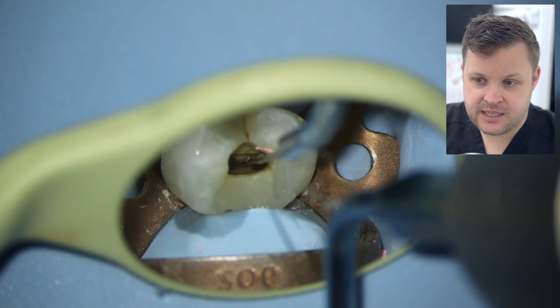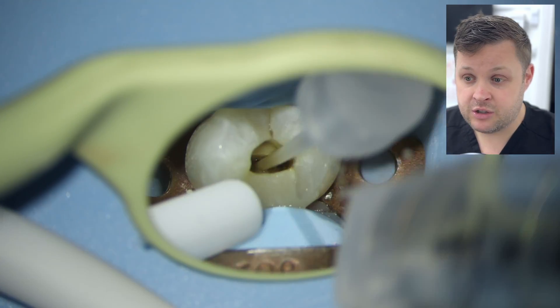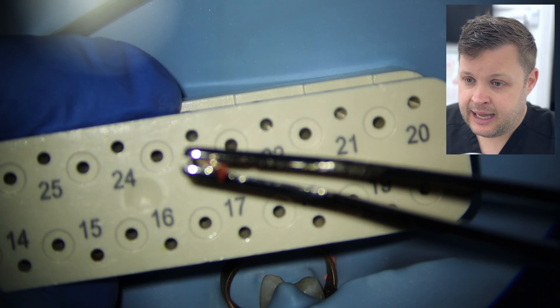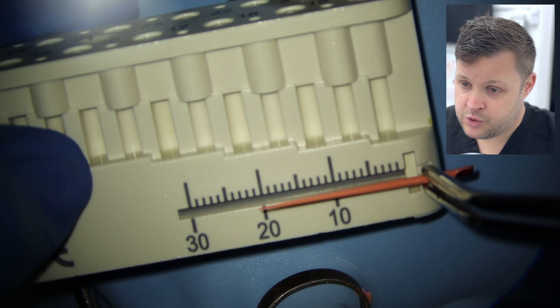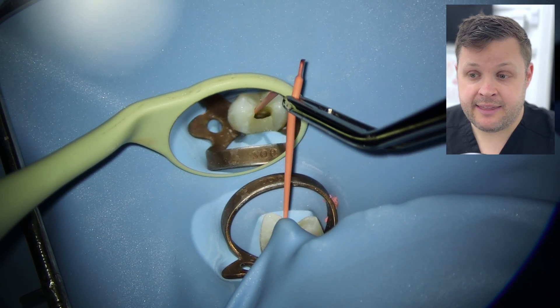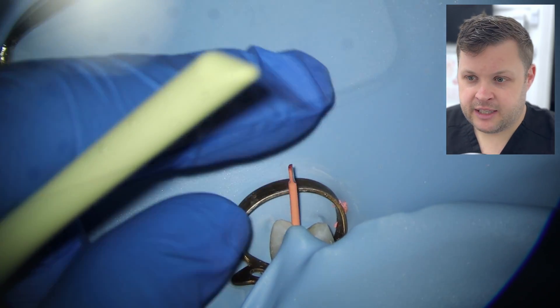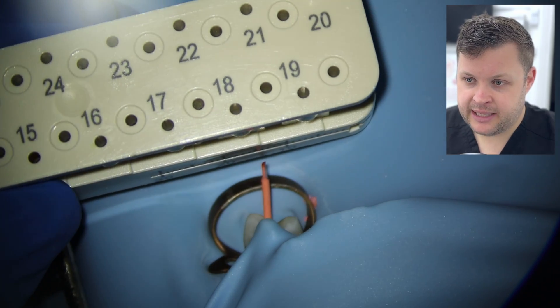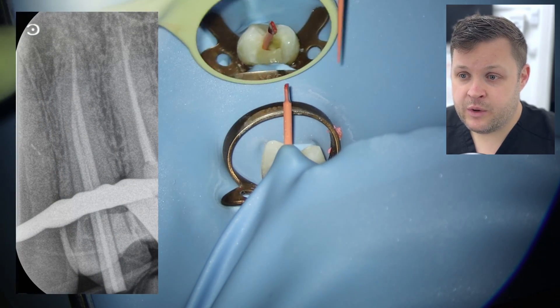I use the Ultra-X ultrasonic activator to activate the remaining GP — I've now used it for three things, showing how versatile it is. Then we proceed with the final irrigation protocol: sodium hypochlorite throughout the appointment, followed by EDTA. Now we prep the tooth for cone fit. We're using a cone 0.5mm from the working length, fitting it to length, and checking for tug-back. Then prepping the cone for the palatal canal, remembering it joins at 20mm from the palatal cusp.